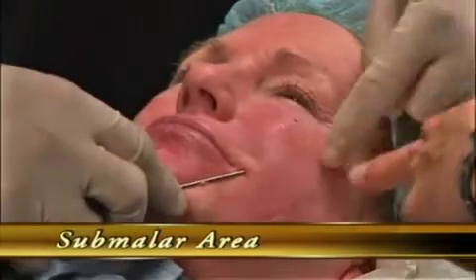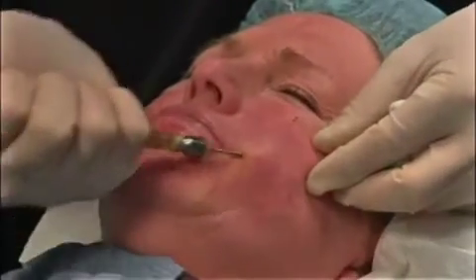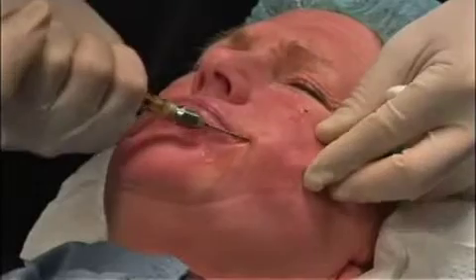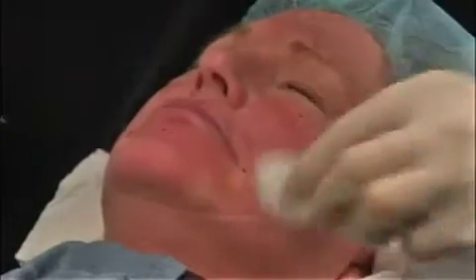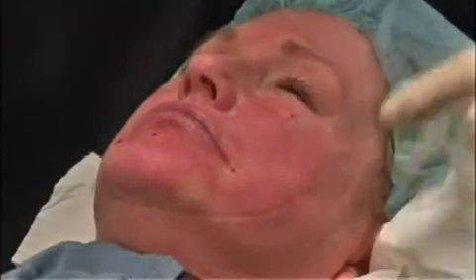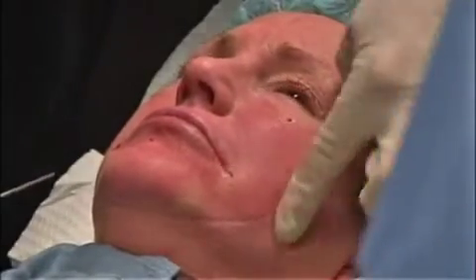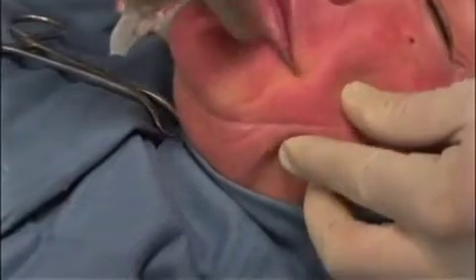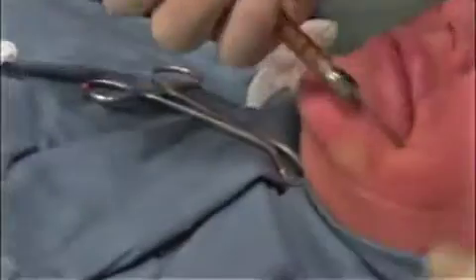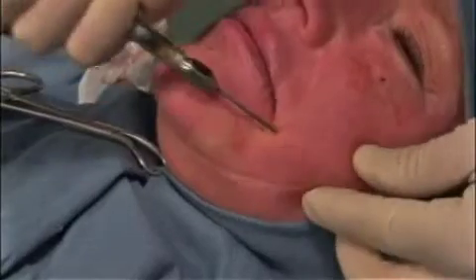The submalar is an area where large quantities of fat can be deficient, with the aging process absorbing the buccal fat pad. Classically, the larger microcannula is used, 1.8 millimeters in diameter. Anywhere between 3 cc's and up to 10 cc's of fat can be placed in this area. As seen here, the skin is undermined prior to injecting the fat to ensure a smooth layer.